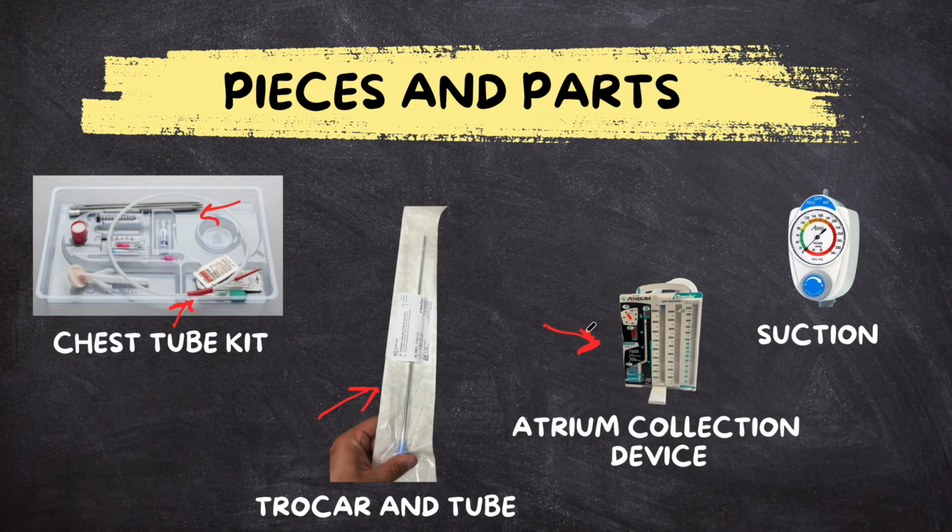And then you're going to need suction set up, more than likely. Now, you don't always necessarily have a chest tube hooked to suction, but a lot of times you do. They can be hooked to gravity, but in this case, we're going to go ahead and get everything ready for suction. That way we have everything. You don't want to be that one that doesn't grab everything that you need along the way, and then they're asking for stuff later.